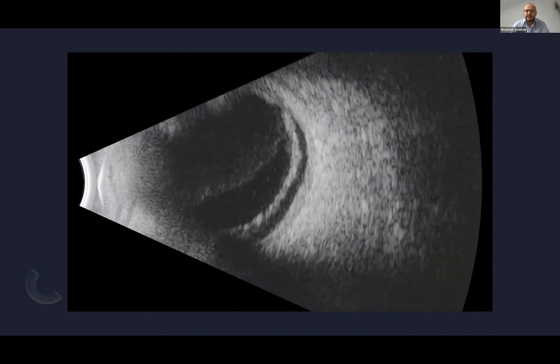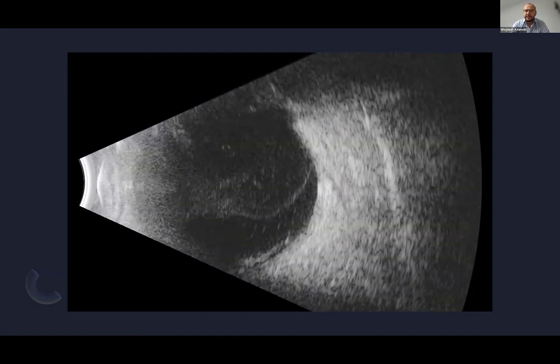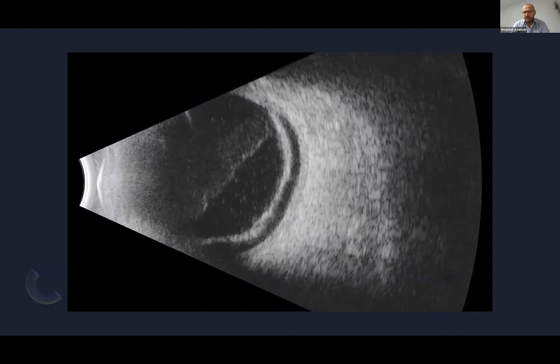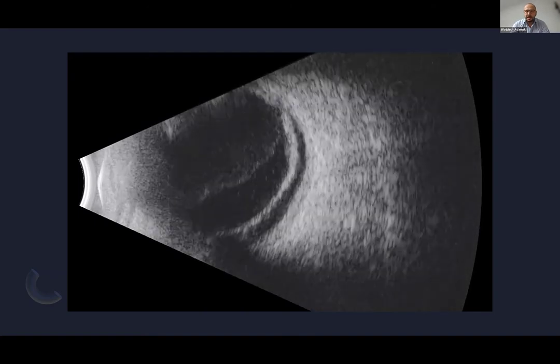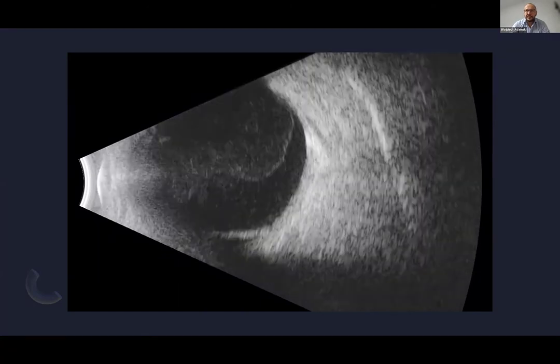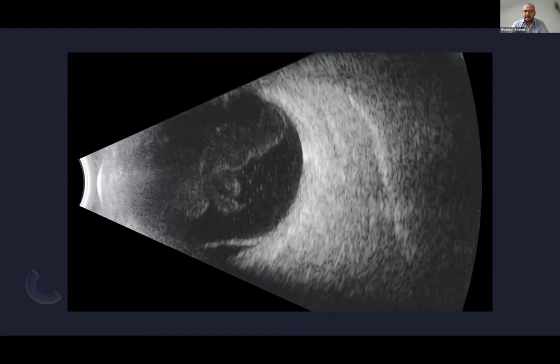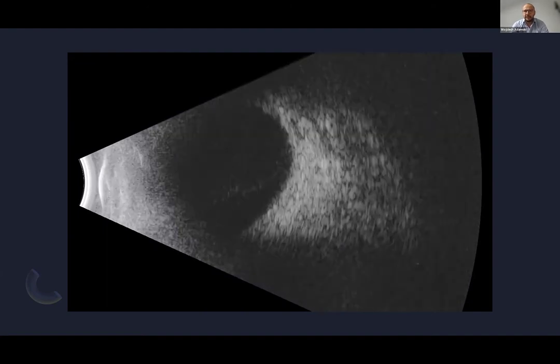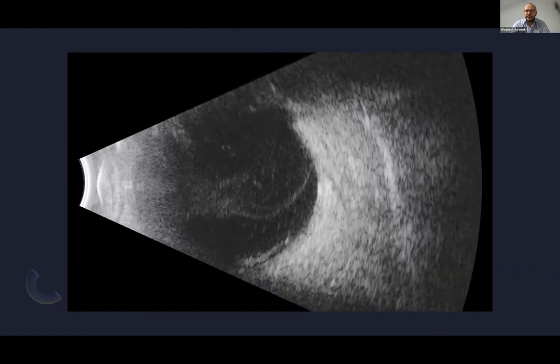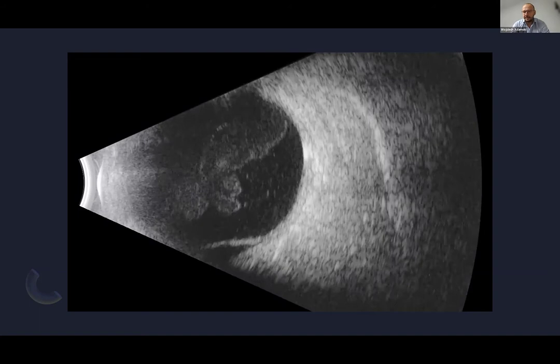Ultrasound seems to be a great tool in diagnosing the vitreous cavity, the vitreous body, because those structures and tissues are composed mostly of water. So it's really a great environment for an ultrasound wave. When examining our patients, we very often, almost always, see the vitreous body.